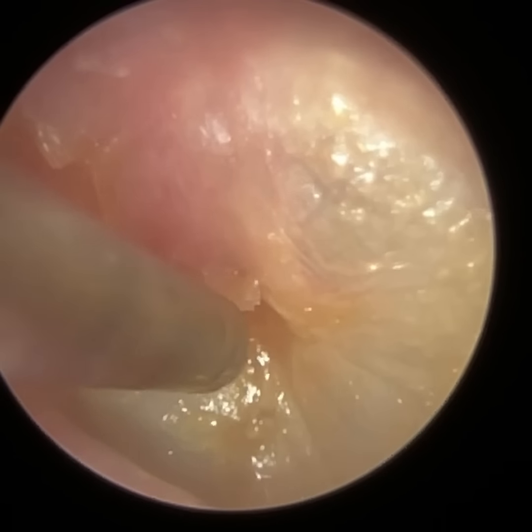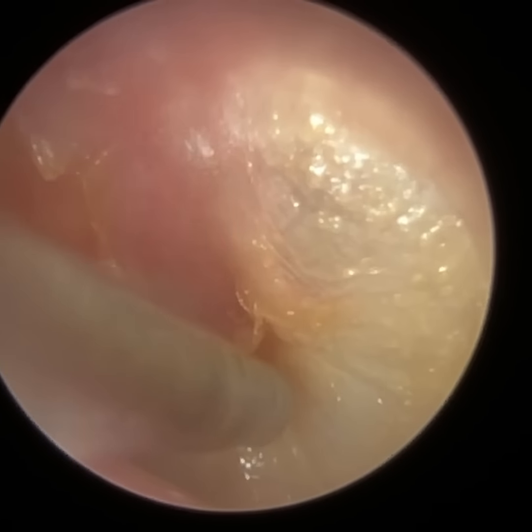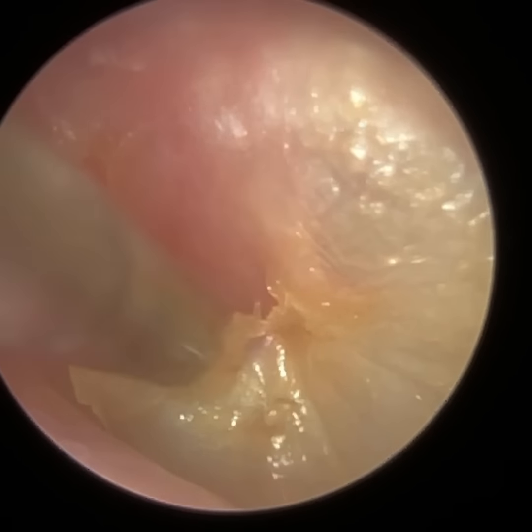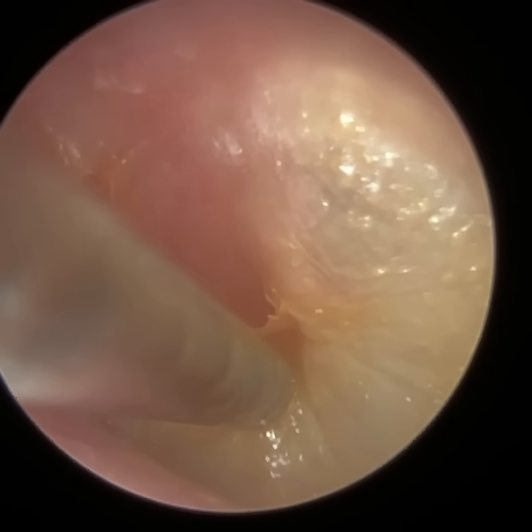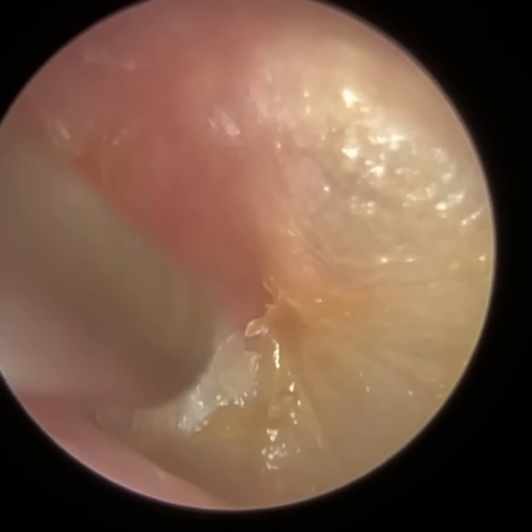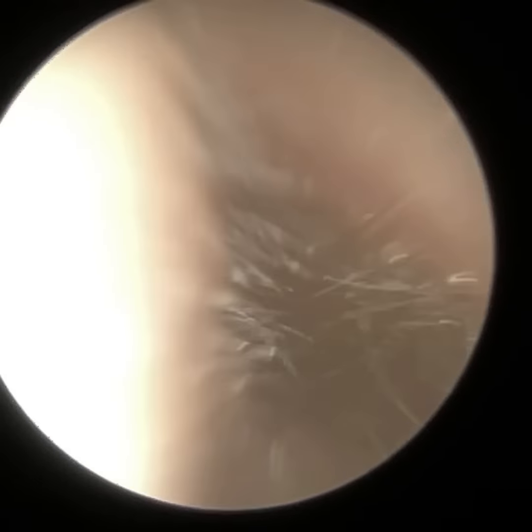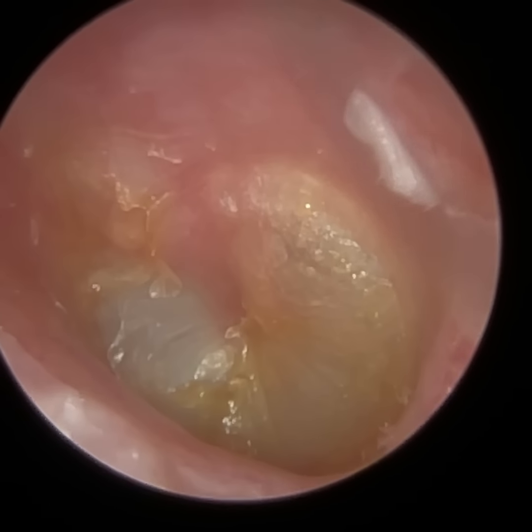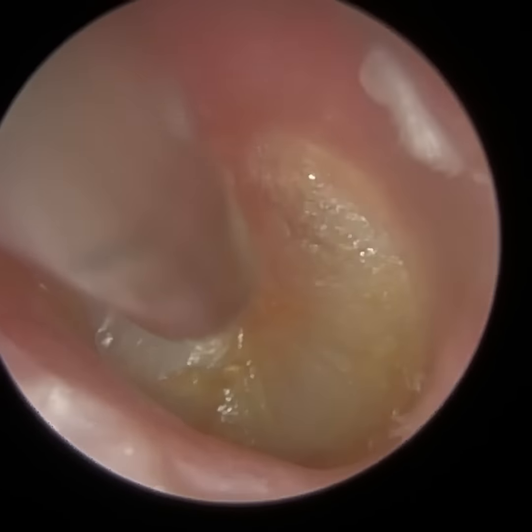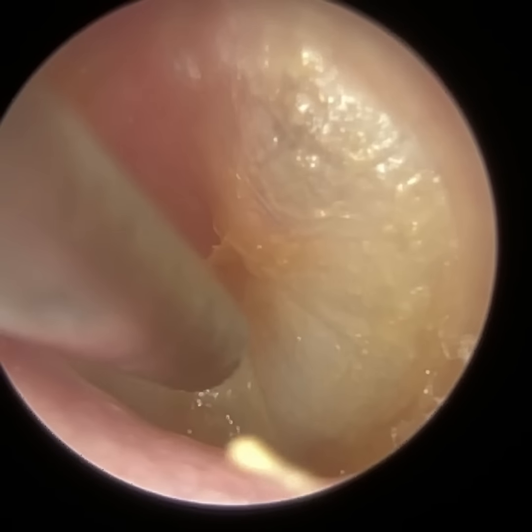So we're right on the eardrum here, just anterior to the hammer bone, just the umbo there, which is the center part of the eardrum, just to the right of the suction probe. You can see this skin is coming away, and you can see the eardrum is a bit more blue in that region. I don't think I'm going to manage to remove all of it, but in comparison to before, it's significantly better. I'm going to have one more go, and I think this is where the patient got a bit dizzy in a moment.